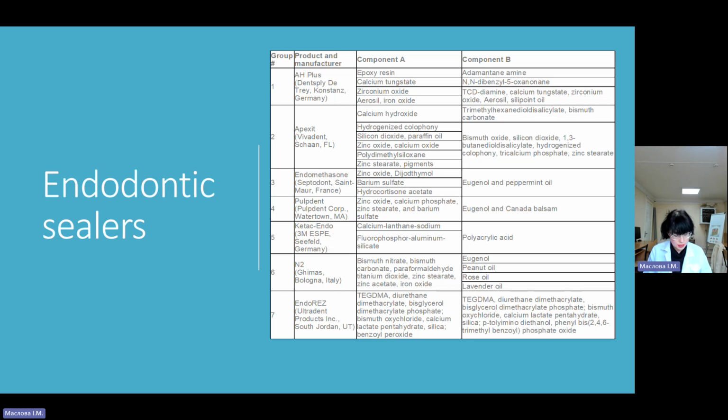And I can tell you about the newer materials. Newer materials focus on the deficiencies of the key groups of sealers and of gutta-percha. Whilst improved placement techniques have provided time and cost savings, some improvements are aimed at replacing gutta-percha, often accompanied by newer sealers. Newer cores are produced from materials designed to match the size and taper of the canal preparation instrument, such that single cone obturation is now considered acceptable.